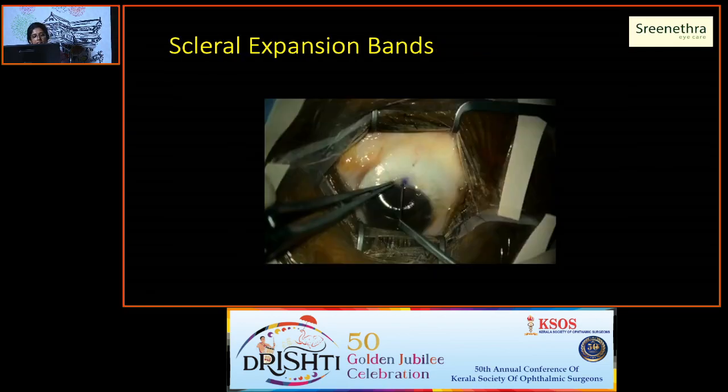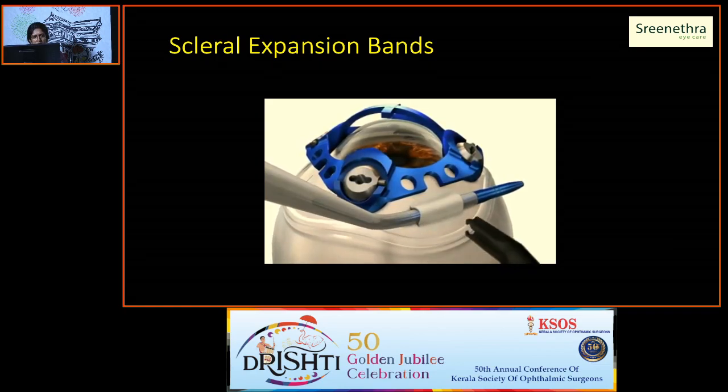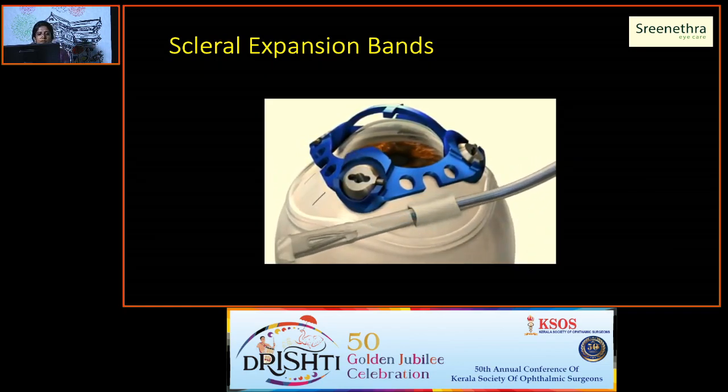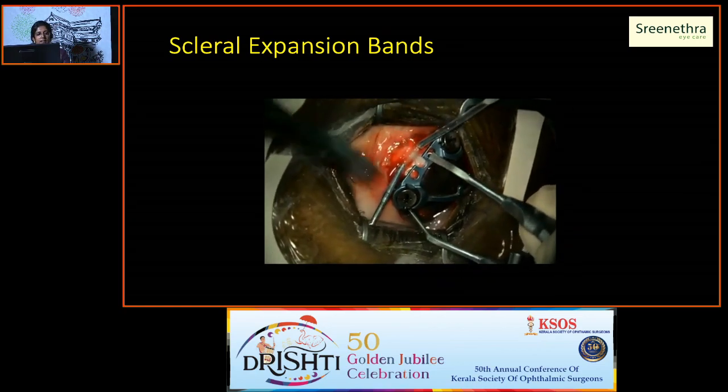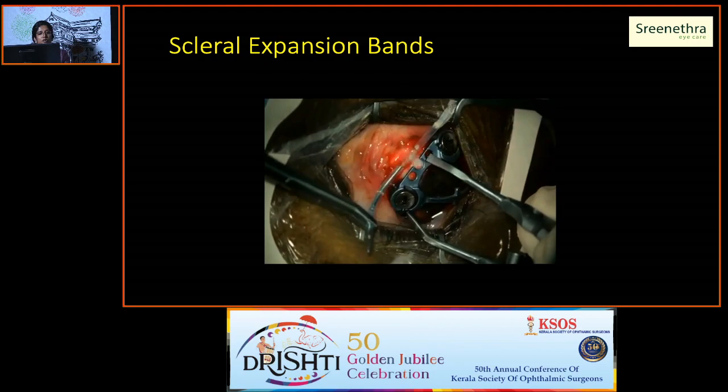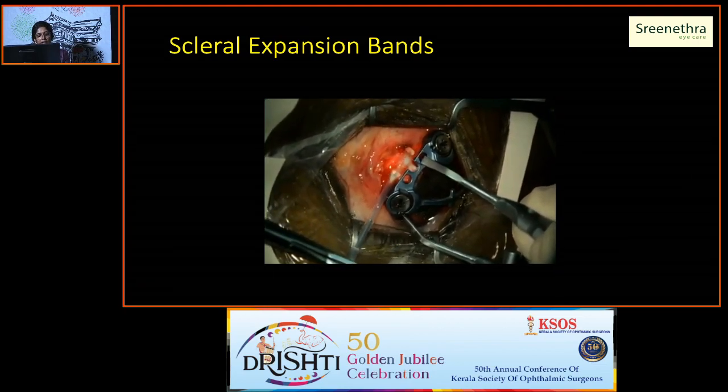And coming to the scleral expansion bands, basically we are putting some scleral bands in the scleral area just above the ciliary process, and thereby creating more tension on the equatorial zonules, and thereby dealing with presbyopia.